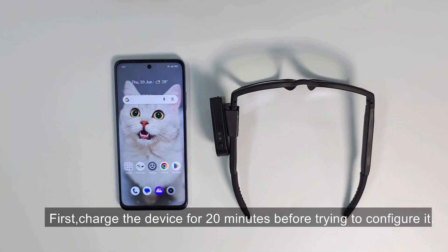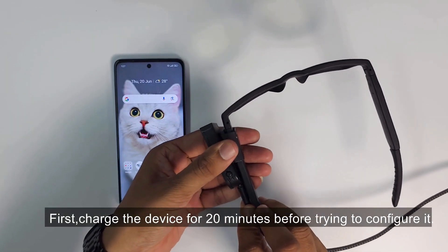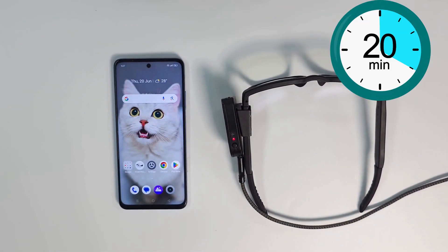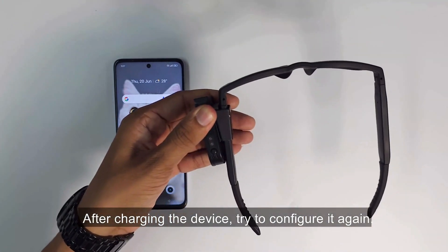If the device is not beeping continuously, try these steps. First, charge the device for 20 minutes before trying to configure it. After charging the device, try to configure it again.